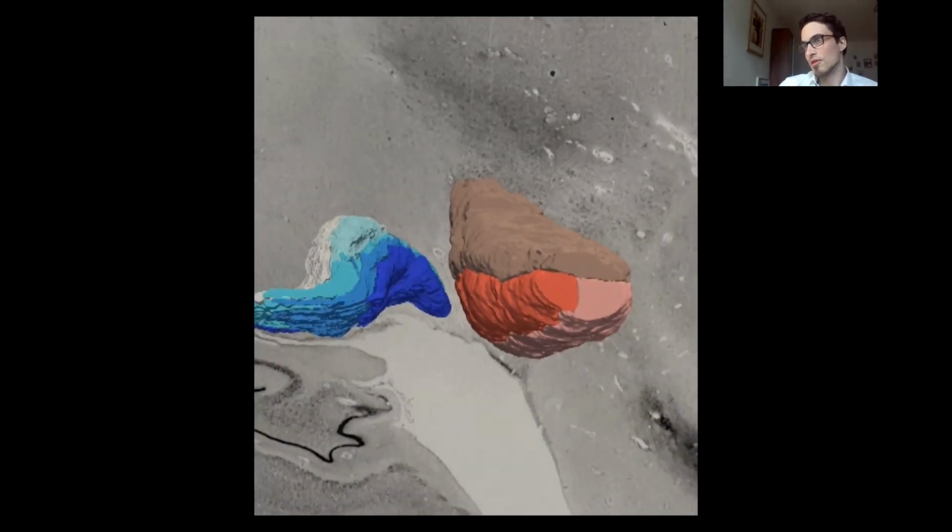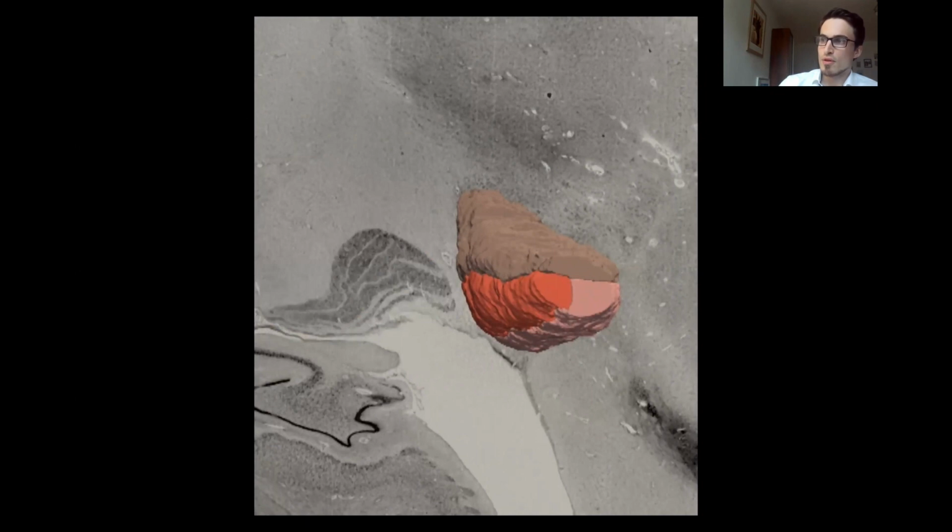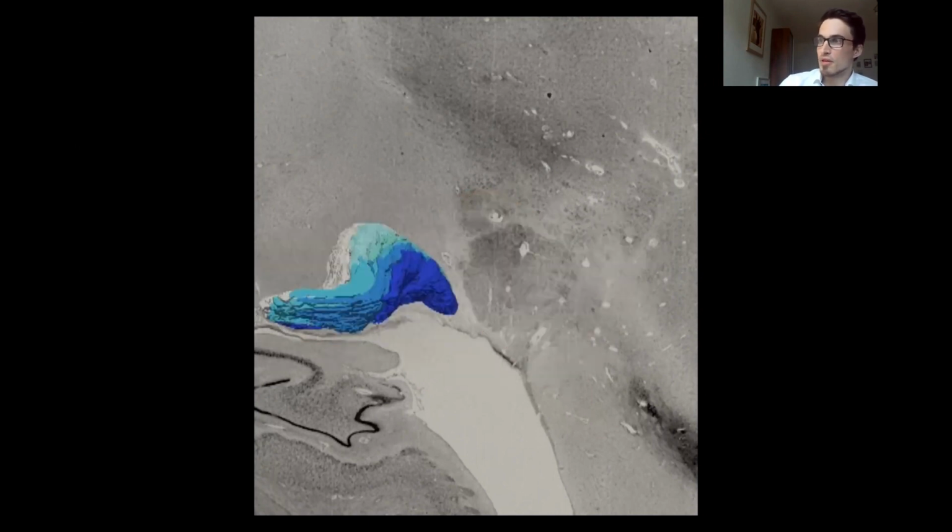On the left side, you can see the lateral geniculate body and its 6-layered structure. If you look at the histology beneath it, you can see the different layers of the structure. As it is blended in right now, on the right side you see the medial geniculate body, and it's fading out in a second now, and also reveals the underlying cytoarchitecture.